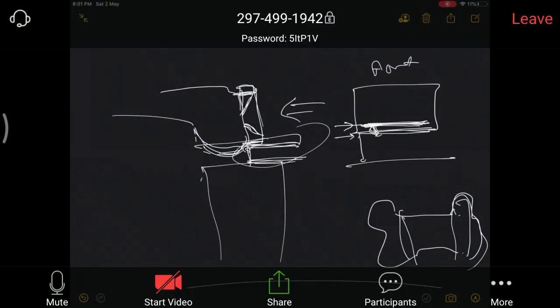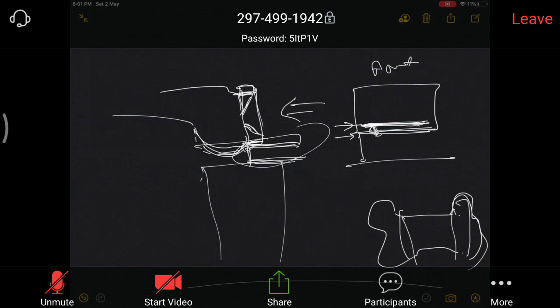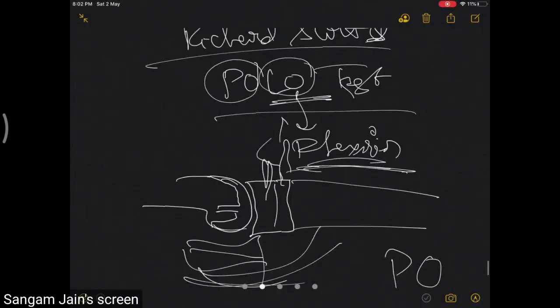You measure the extension gap with the extension spacer. To know the flexion gap, you can use the spacer block with the 4-in-1 block, or you can use the lift off and pull off if you have committed the cut already. You cannot use a spacer block once you have committed. There is another way also to know whether the flexion gap is correct or not.